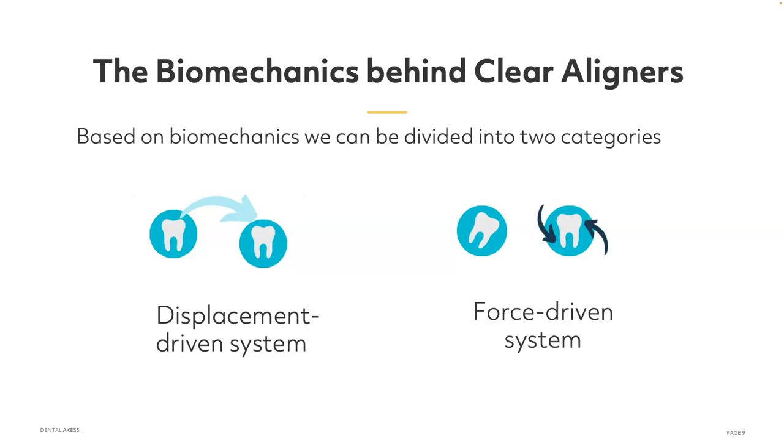It's basically that the aligner has a pressure point. That means the aligner will move the teeth, creating pressure in some areas. This, with attachments, gives us the chance to create more complex movement, like big rotations or significant torque, extrusion, for example. So this opens up more complexity in the cases, because the tooth does not need to move to fit into the aligner. The aligner will make the movement, creating pressure in specific areas.